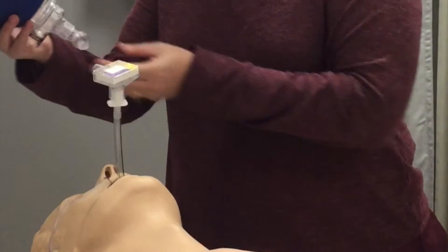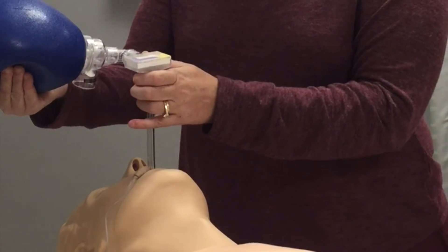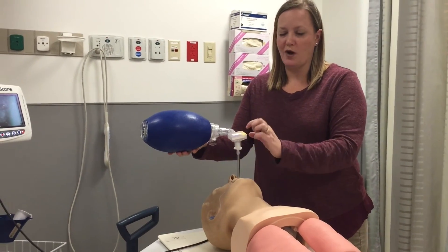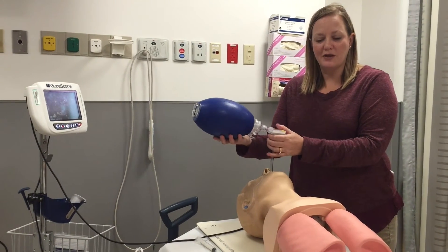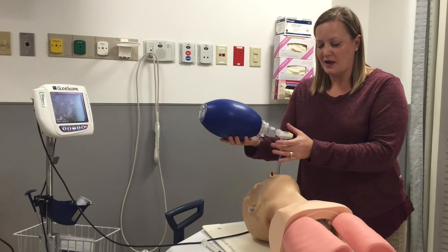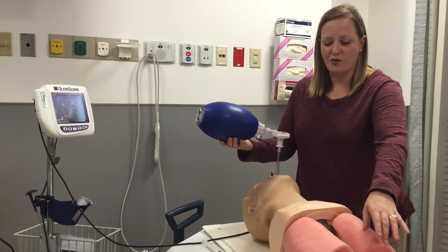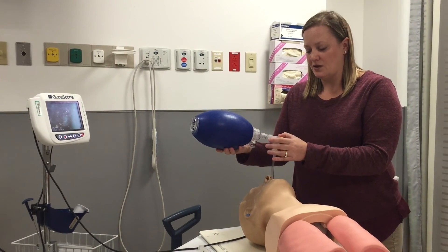You'll place the bag on the CO2 detector and you will bag the patient. You will be watching for color change in the CO2 detector, and also listening to the patient's lungs to make sure you have equal breath sounds on both sides. You will listen to both lung fields and then listen over the epigastrium to make sure that you have not intubated the esophagus.